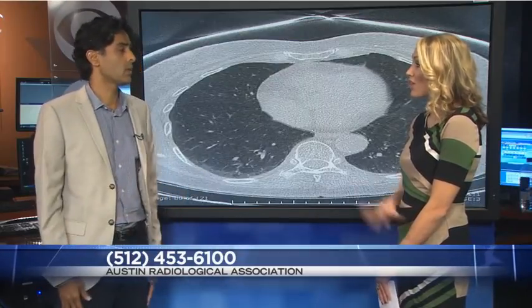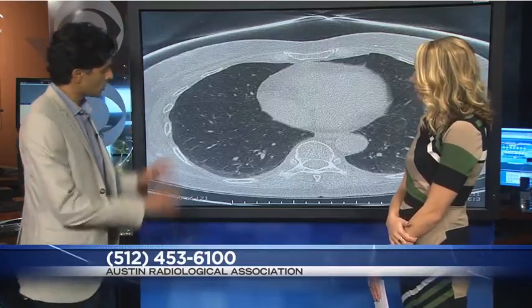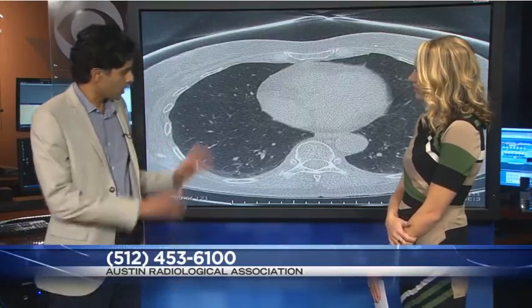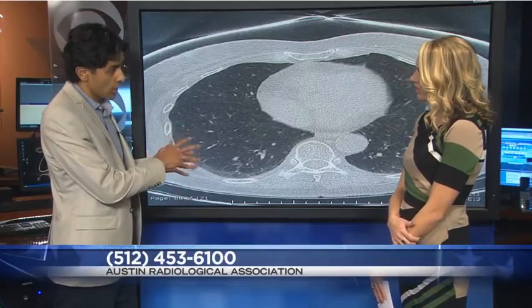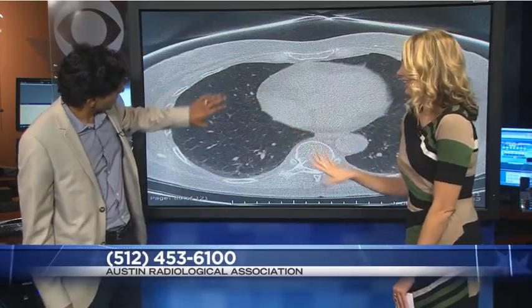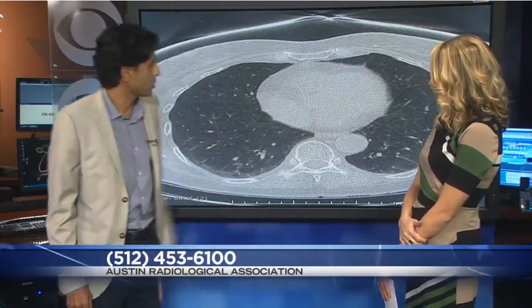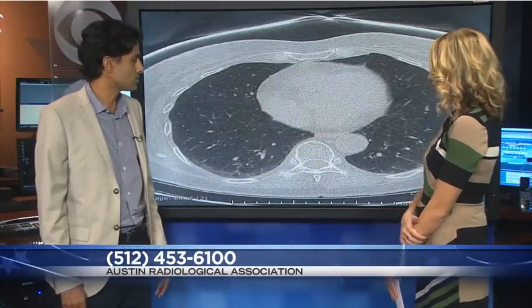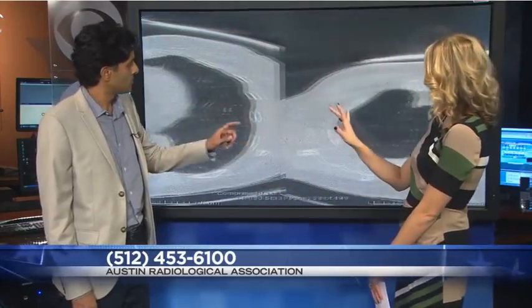So you have some visuals to show us? I do. What are we looking at here? This is a normal lung. It may not be readily evident, but these are the normal soft tissues and air-filled spaces that are the lungs. Just to make sure I understand, these are the lungs right here? Yes. Lungs, heart, aorta, backbone, just to localize everything. And this is a normal lung. You got it. So there's more to look at? There's more to look at.